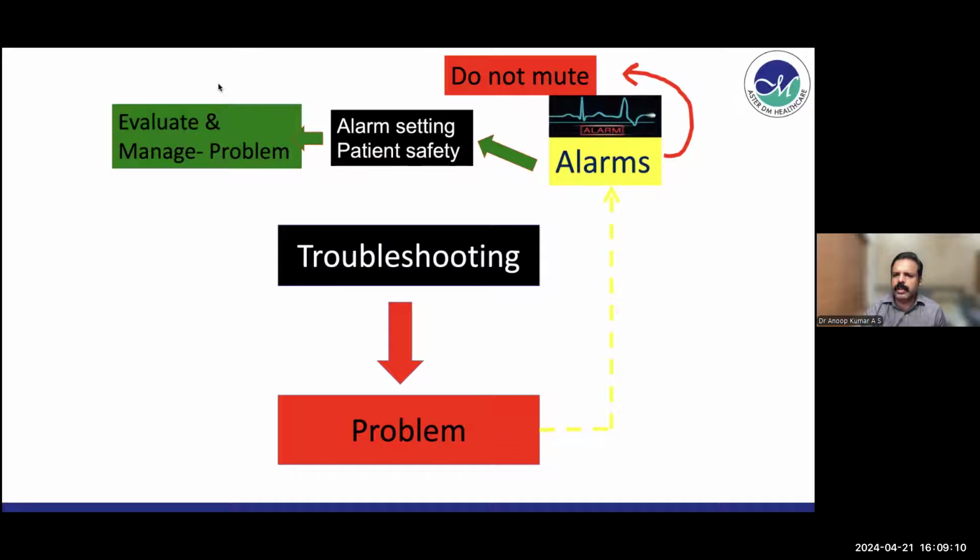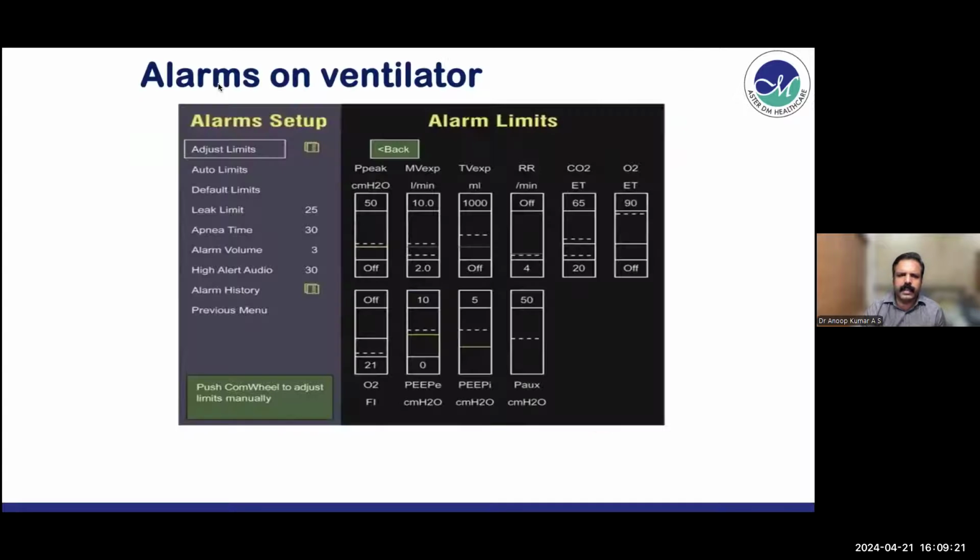As I've already told, whenever there is an alarm, we tend to mute it immediately, whether it is a junior doctor or a bedside nurse. But alarm is not for that. It is for patient safety.